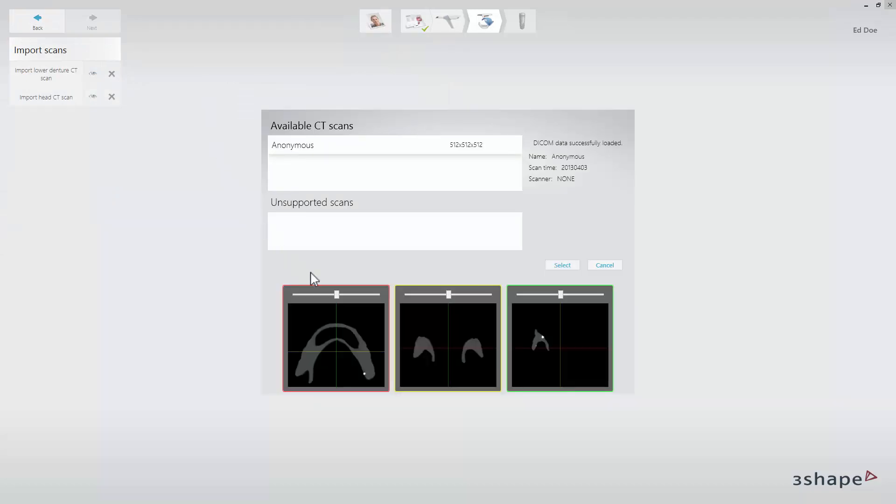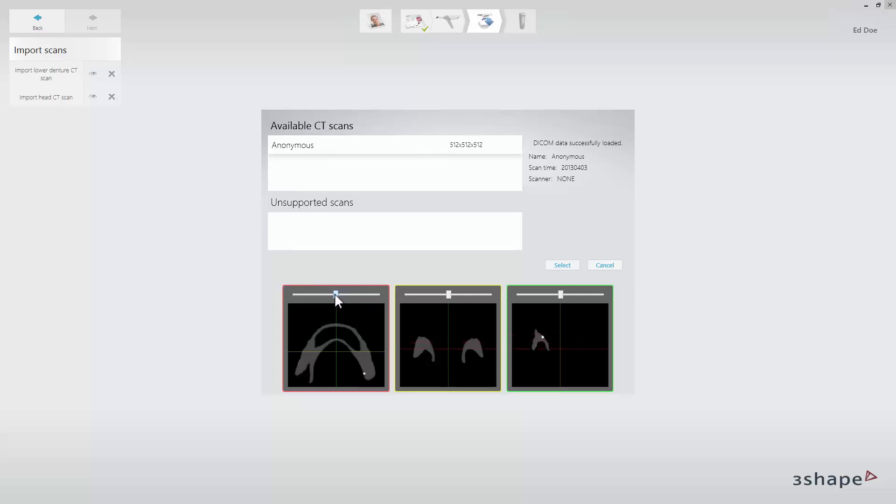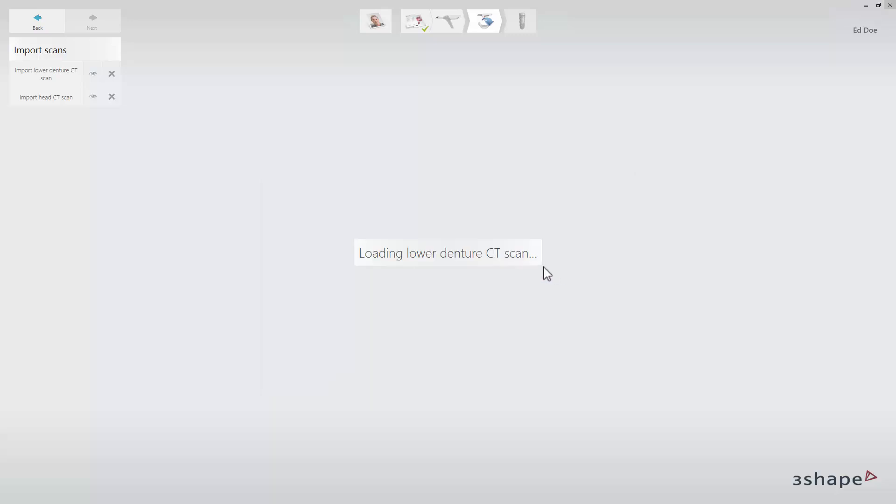Using the sliders, scroll through the content in the 2D cross-section. Click select to load the scan. The 3D preview of the denture will appear on the screen.